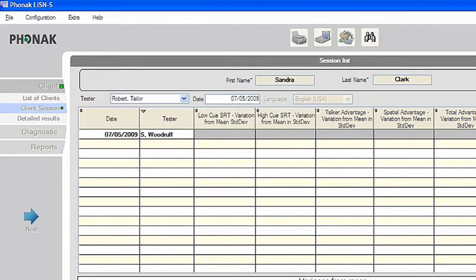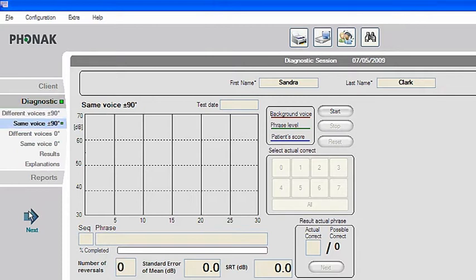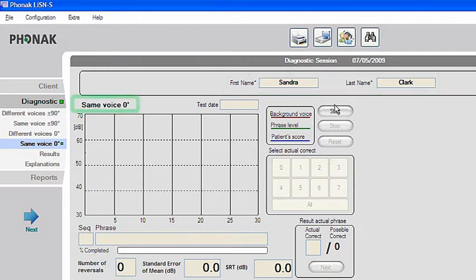Listen S uses four different test conditions and these must be administered in the correct order. The big arrow will lead you automatically through these conditions in the required sequence. The screen you see here is called the playback screen. Make yourself familiar with this, as this is an important screen. You will see the client's name, the test condition, and stop, start and reset buttons, which start, stop and reset this particular test condition.